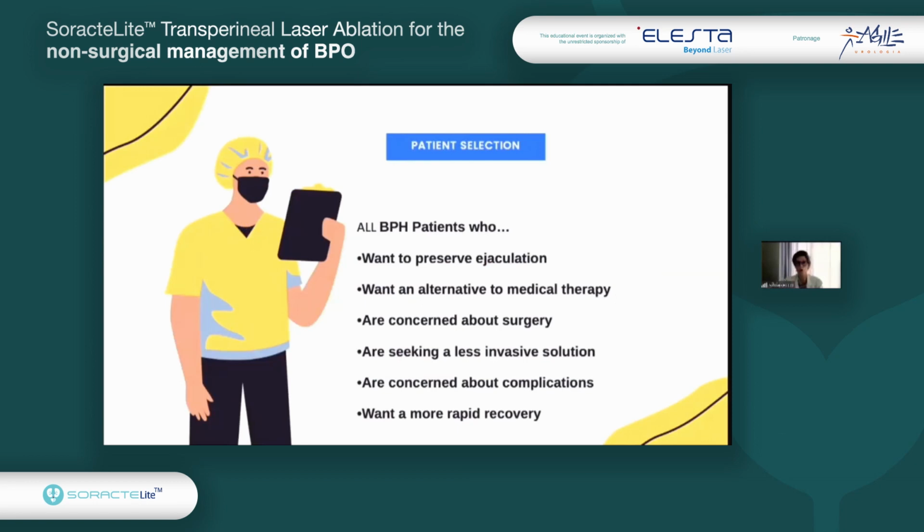All BPH patients that are keen to preserve ejaculation can be treated with Urolift. Also, if these patients want an alternative to medical therapy, are concerned about surgery, don't want to undergo the procedure under spinal or general anesthesia, are looking for something not invasive at all, or are concerned about complications. And also for patients who want a really rapid recovery, because after the Urolift placement they can go home and do normal activities the day after the surgery.